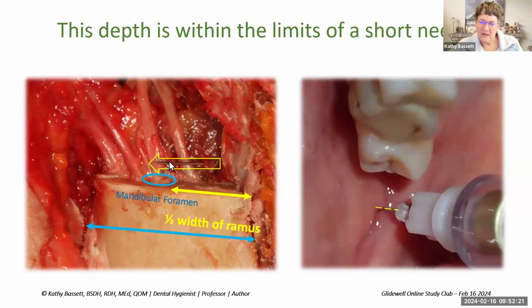One thing I do want to say is that I never advocate for the use of 30 gauge needles, particularly for these injections. I'm okay with a PDL, but for these deeper insertions, I just like that feeling of particularly a 25 gauge needle. 27s are okay, but that sense of rigidity and really knowing, feeling where I'm at, I think is beneficial in these injections.